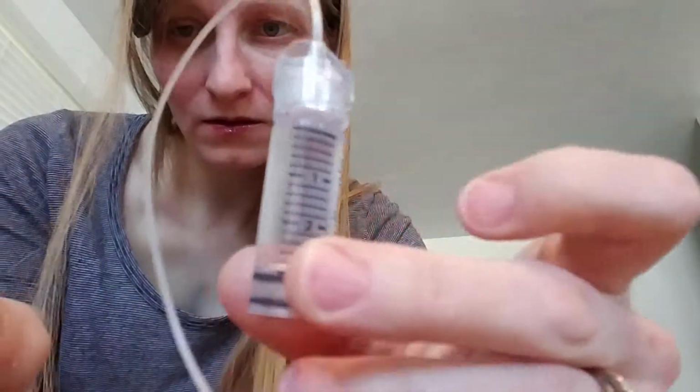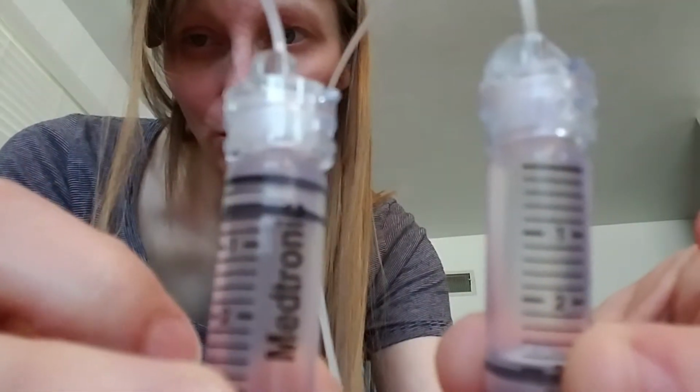And 15 units is about half a day's worth of insulin for me, so that would make a significant difference and cause my blood sugar to go extremely high if I didn't prime it. So I need to remember, I take off my pump. I have it on my thigh right now, my infusion site, so it's tricky. Okay, so this is the old tubing. I'm gonna untwist it from my pump. Let's see if we can see the differences here, the new and the old.